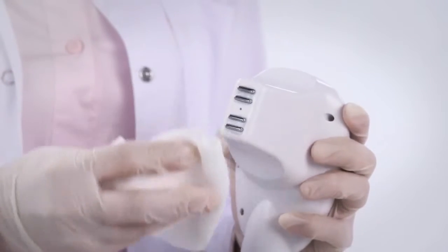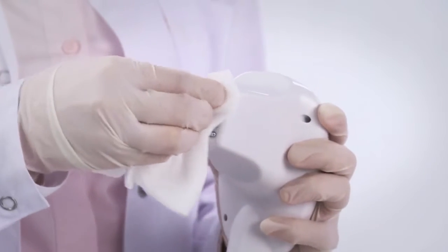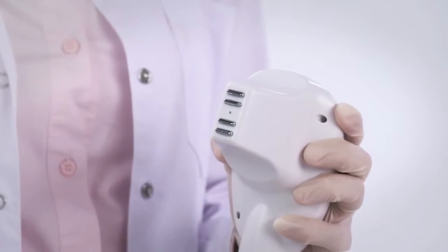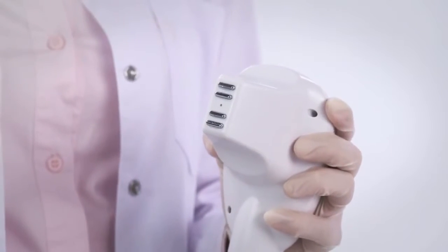After completing a treatment, clean the handpiece well with a soft cloth moistened with 70% medical alcohol to disinfect the handpiece, and then dry the handpiece with a clean towel.